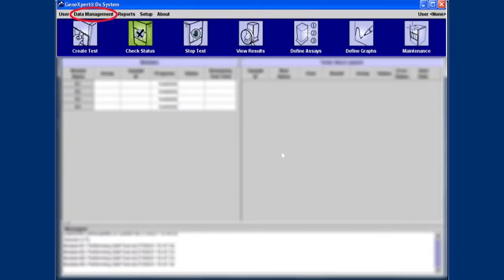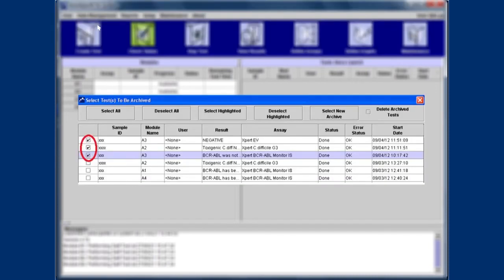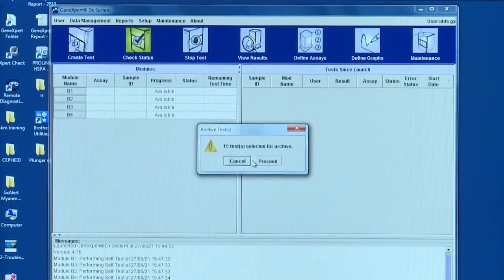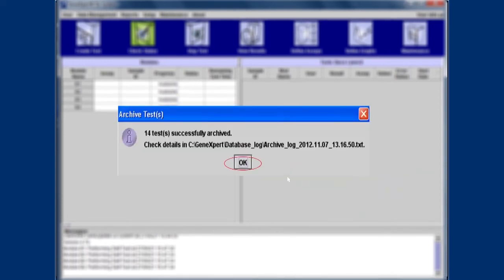Finally, we will demonstrate how to archive the GX results. Test data should be archived monthly or once every three months. For archival of results, click on the Data Management menu in the GeneXpert DX system window, then click on Archive Test. Select the tests you want to archive when the Archive Test dialog box appears. Then select Delete Archive Test in version 4.0, or select Purge selected test on the list after archiving in version 4.6. Then click OK and proceed. The file name will be given automatically, but you can change it if you would like to. In this way, you can perform the monthly maintenance procedures systematically.